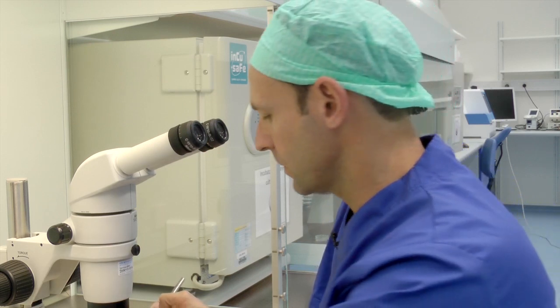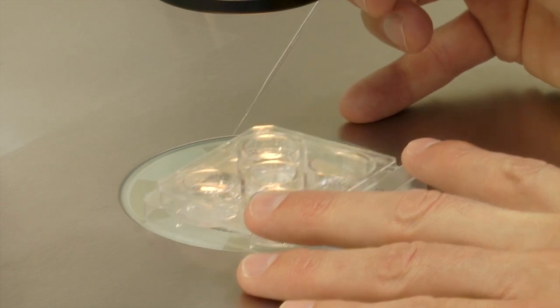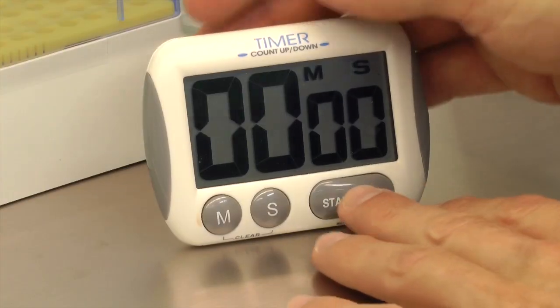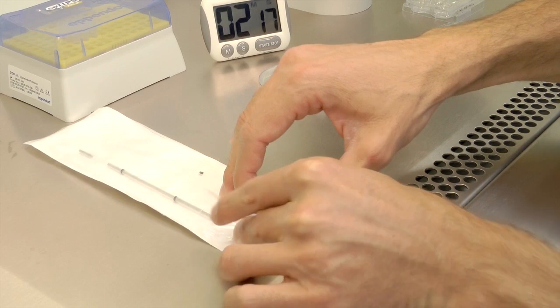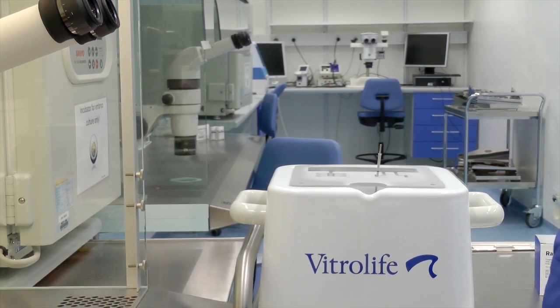After 5 minutes in the first solution, move your oocytes into the second solution. The oocytes will remain in the second solution for between 2 and 5 minutes. What we are looking for during this step is re-expansion of the oocytes. Make sure that you roll the oocytes during this step to ensure that re-expansion has indeed taken place. During the second step, label your straw and then place it inside the smart box, making sure it is held in position securely by the magnets. This will give enough time for the air inside the straw to cool down.